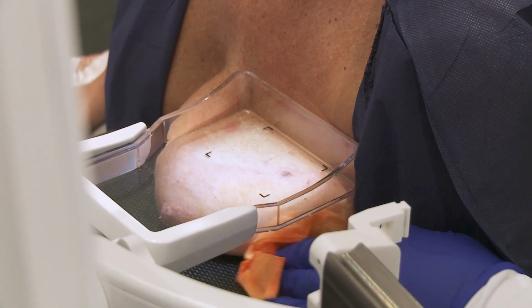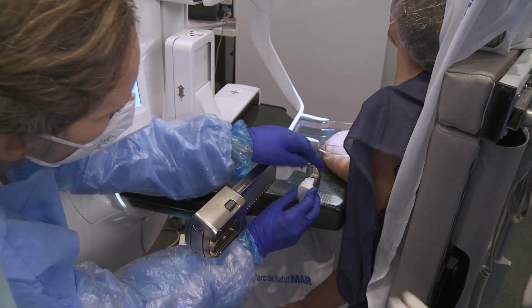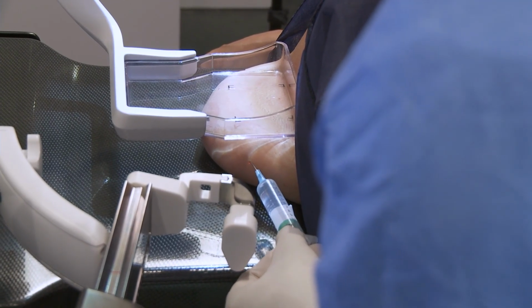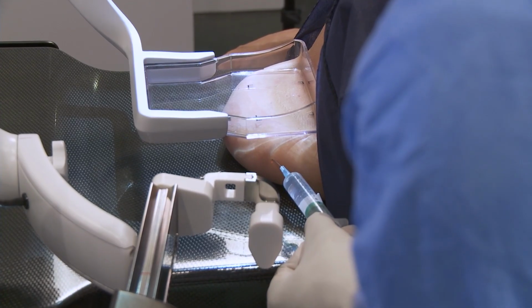Proceed with skin disinfection. Insert the needle guide support. Insert the laser to mark the precise skin incision location. Inject superficial anesthesia to be followed by deep anesthesia.